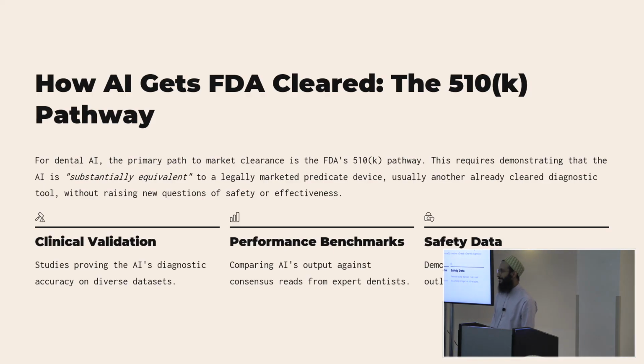I think the resolution of the radiograph is also important. Yeah. Resolution is important, but part of the data gathering that we did in the beginning was to gather poor quality radiographs. Because when we started, it was 2019, and a lot of people didn't have high quality equipment then.